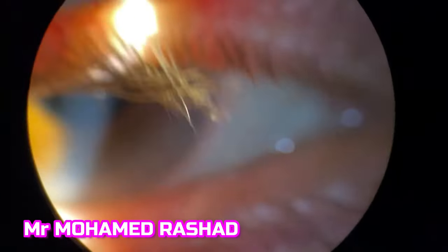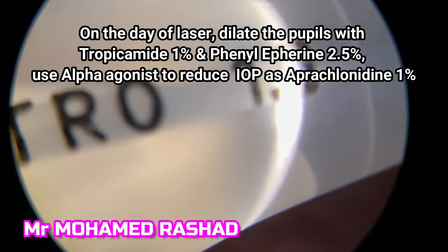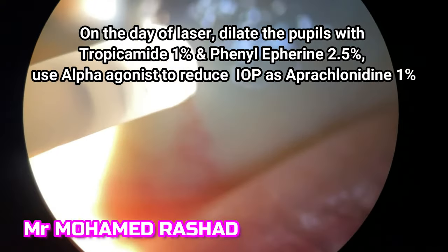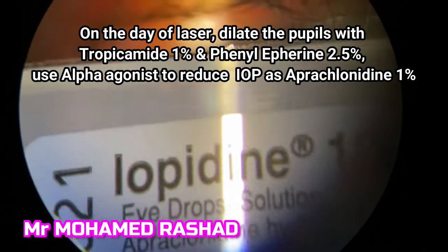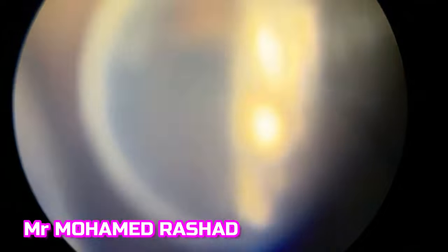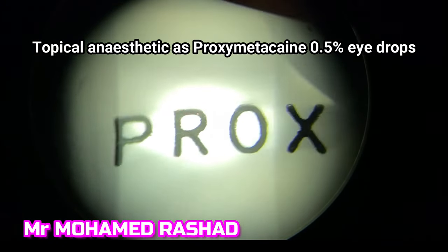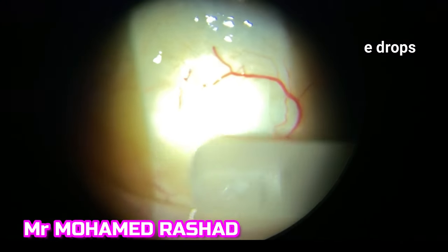On the day of the laser, make sure that the patient is well dilated by using tropicamide 1% and phenylephrine 2.5%, and use an alpha agonist to reduce intraocular pressure, such as apraclonidine 1% eye drops. Then use topical anesthetic eye drops, such as proxymetacaine 0.5% eye drops.